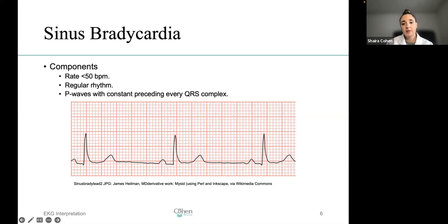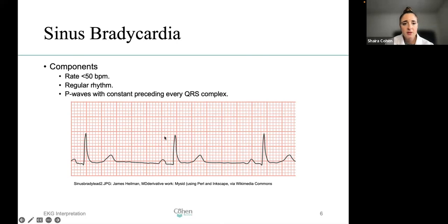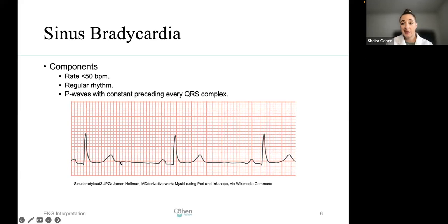Let's look at an example: sinus bradycardia. It's a heart rate of less than 50. The rhythm should be regular, and P waves are constantly preceding the QRS complex. When you look at the spaces between the QRS complexes, they're about six large boxes apart — and consistent — which tells you the rhythm is regular. The spaces are quite large, indicating the heart rate is about 50. There is a P wave, the rhythm is regular, and the heart rate is slow.